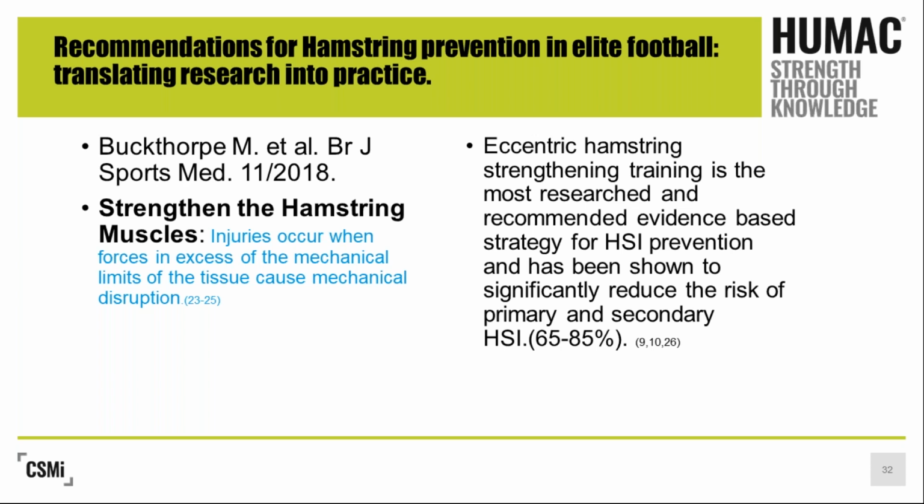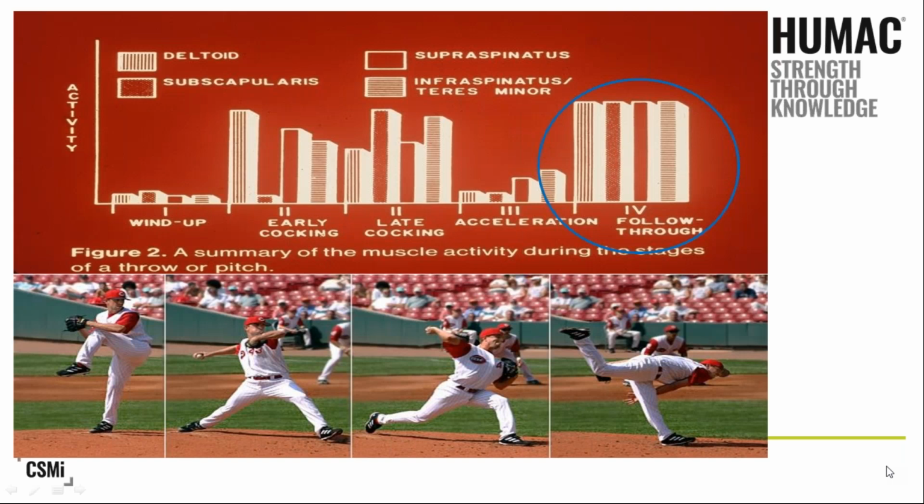Now, a lot of us do eccentric loading hamstring exercises in a variety of different ways. If you do RDLs, if you do Nordic hamstrings, if you do mechanical work associated with eccentrics, it's important for us to be able to train that way. But are you testing to determine whether or not they have the symmetry and the strength to return to function at a high level of activity?